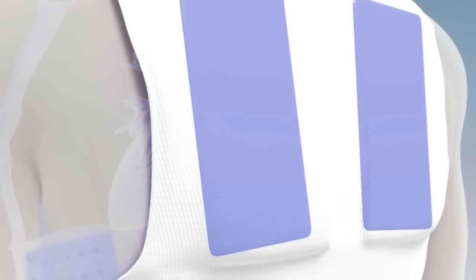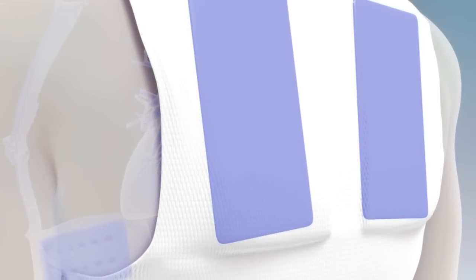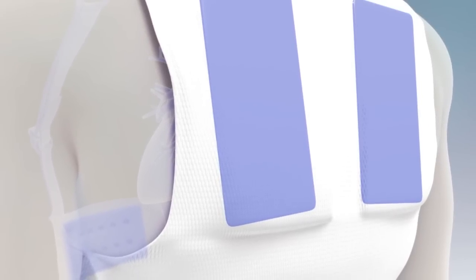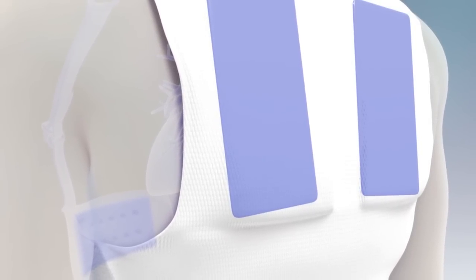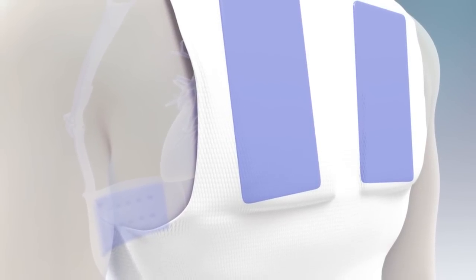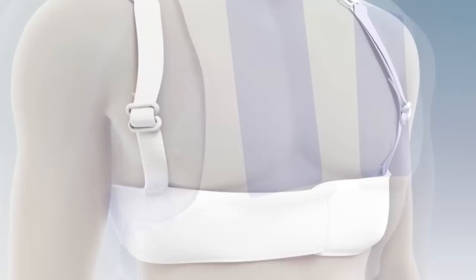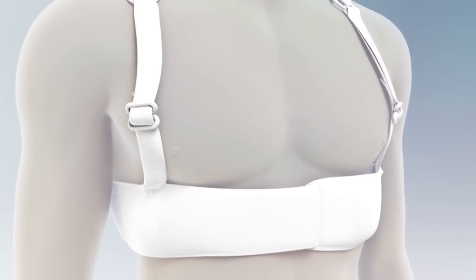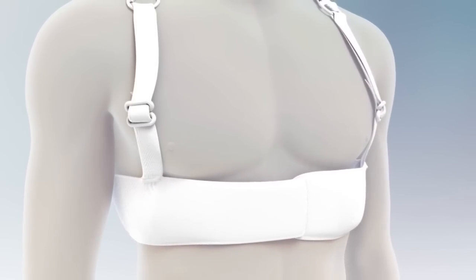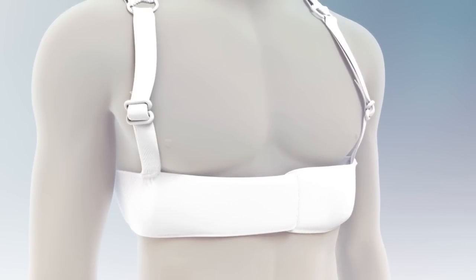Blue gel on the patient's chest and back is an indication that the patient may have been treated. The LifeVest deploys blue gel prior to delivering a treatment shock. The purpose of the gel is to improve shock conduction and minimize burning. This gel should remain on the patient as long as they continue to wear the LifeVest. However, if you choose to remove the LifeVest and monitor the patient with your external equipment, the gel can be removed using water.